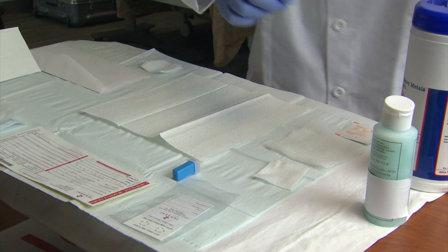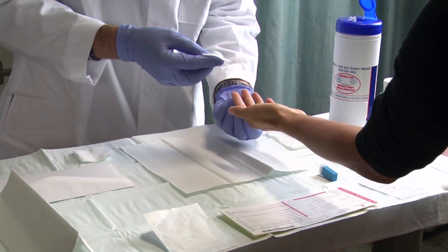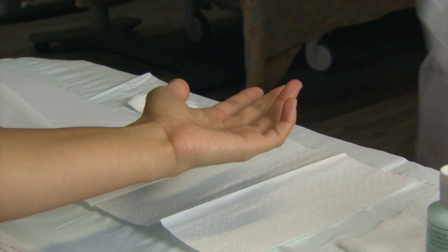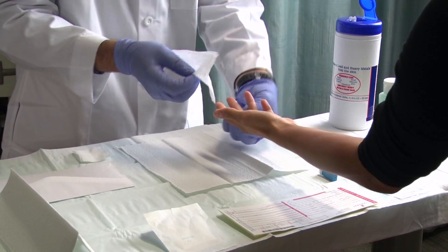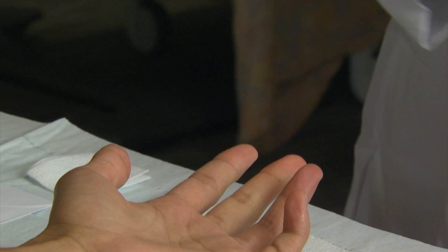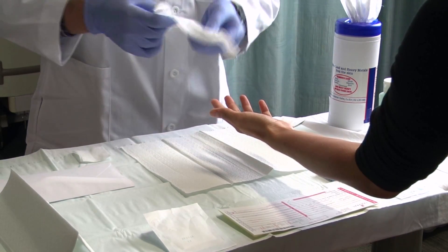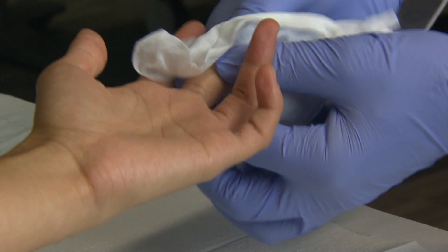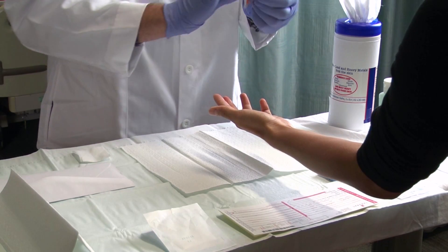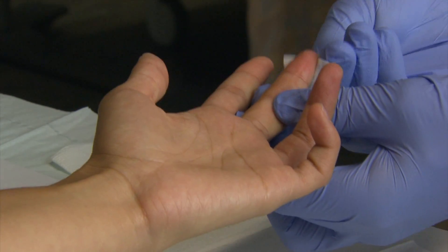Wearing gloves, cleanse around the finger stick area with the appropriate cleanser. Remove soapy residue from the finger with the large unsealed gauze pad. Wipe the area with a specific lead and heavy metal cleaning wipe that is designed to remove surface skin contaminants — this is a crucial step in the testing process. Disinfect the finger stick area with alcohol and dry with gauze.